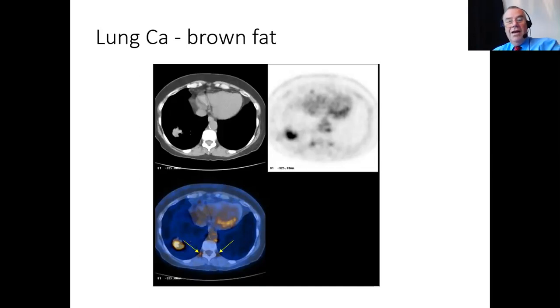Yes, as it says here, the positron range can play a role here, but not major. Yeah, that's true, Mohammed. It can, particularly if you have very energetic positrons. F18 sits in the middle, but if you're doing things like I-124, it can be helpful as well. That can obviously give you a better signal in terms of resolution, but it will mean that you may see smaller lesions, but it may well be that your localization will be reduced. So that is true. Positron range will have something to do with it.